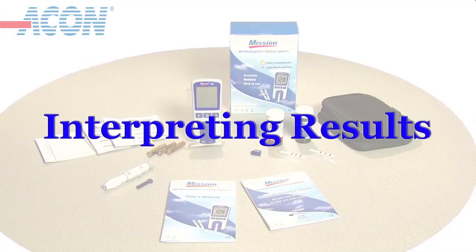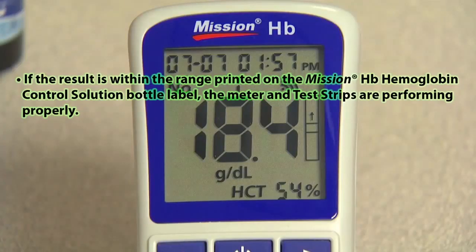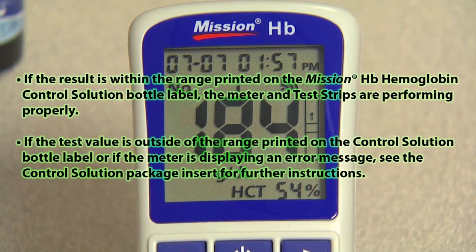Interpreting results. If the result is within the range printed on the Mission HB Hemoglobin Control Solution bottle label, the meter and test strip are performing properly. If the test value is outside of the range printed on the Control Solution bottle label, or if the meter is displaying an error message, see the Control Solution package insert for further instructions. Please contact your local distributor for additional information.